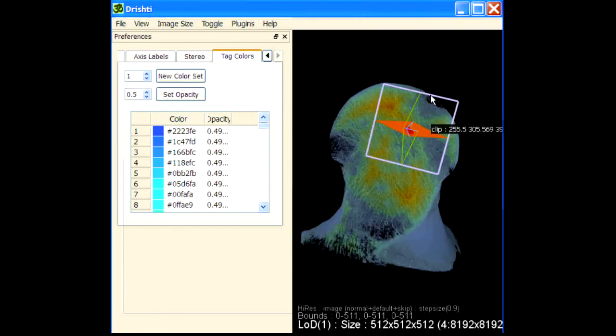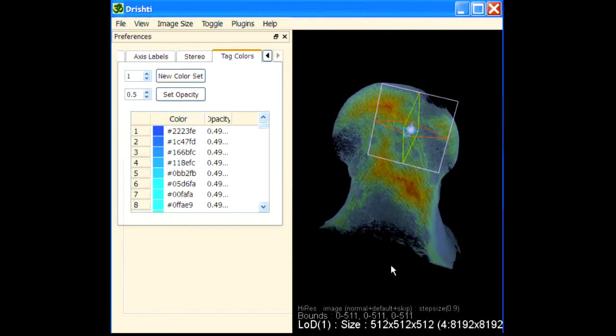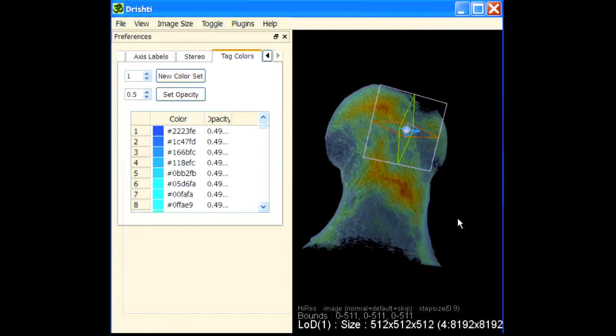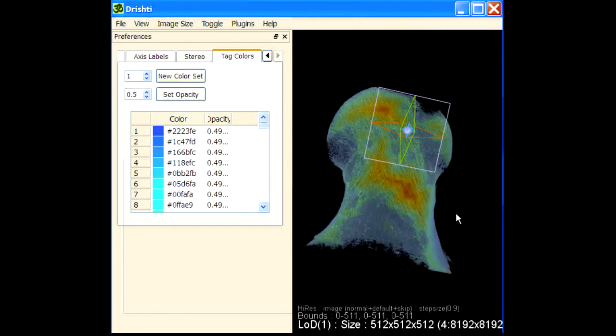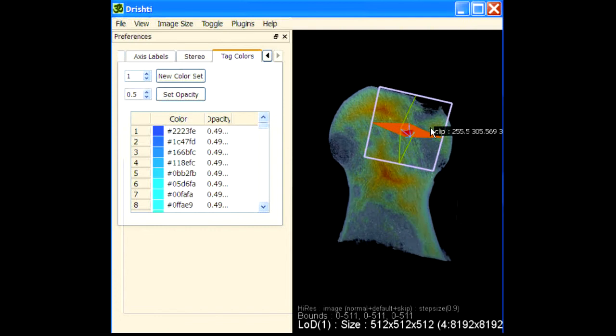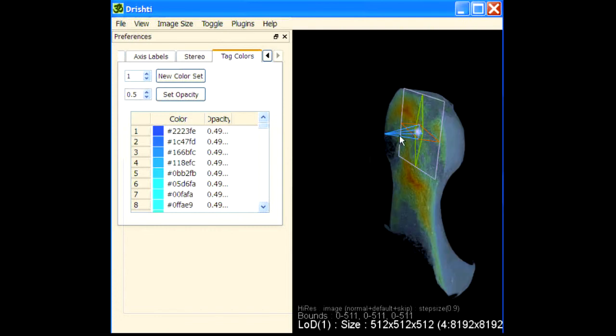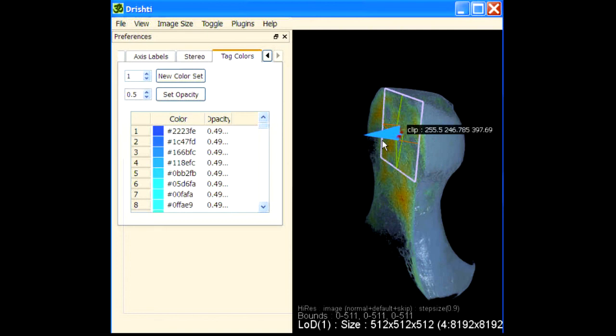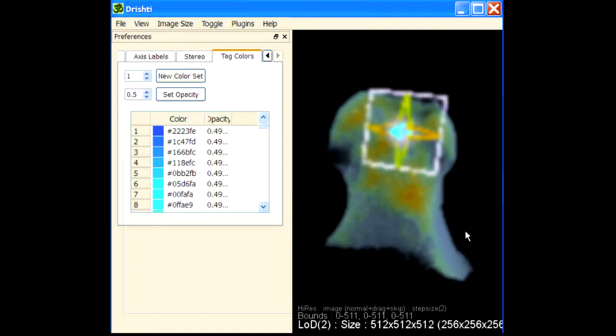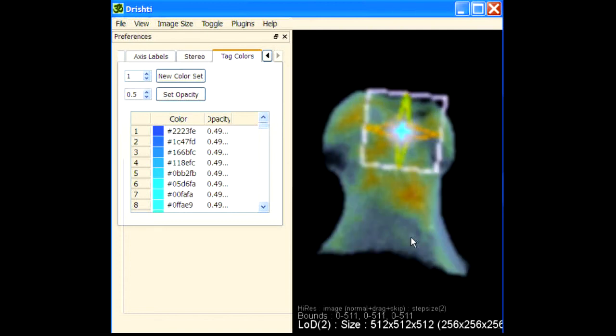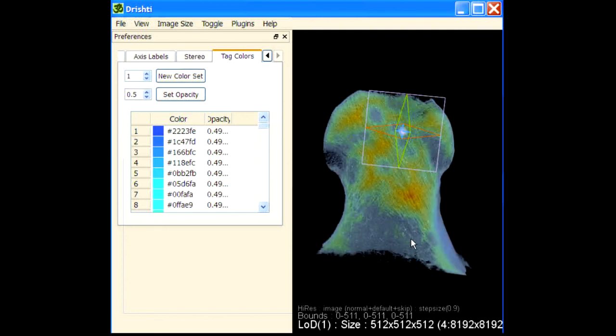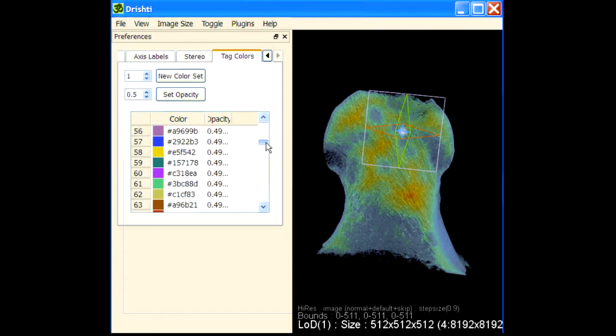This is how you can get distance measure, distance visualization, say thickness in the bone or thickness in whatever region that you want. You can put those values in channel 2 and you can get the regions.